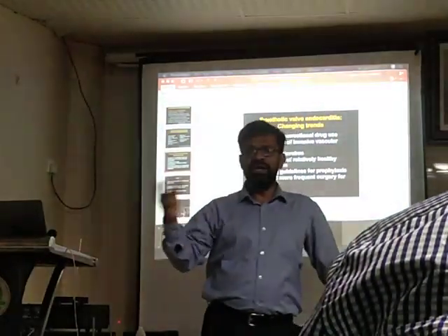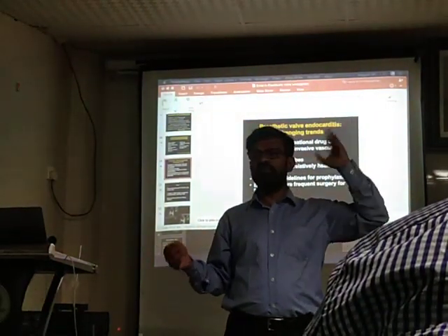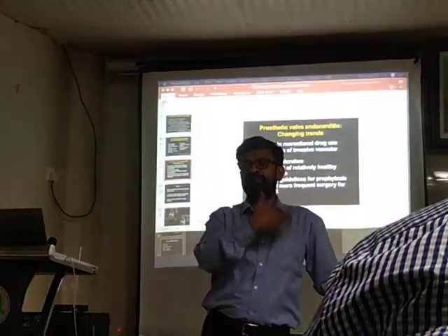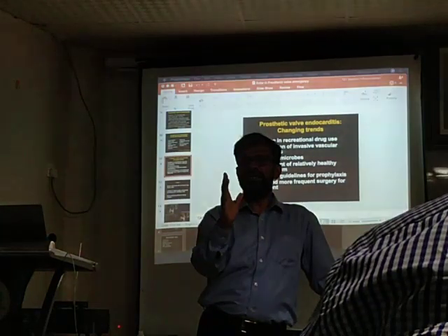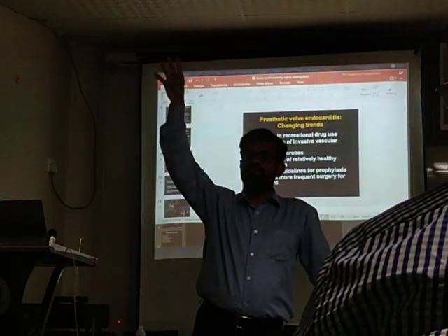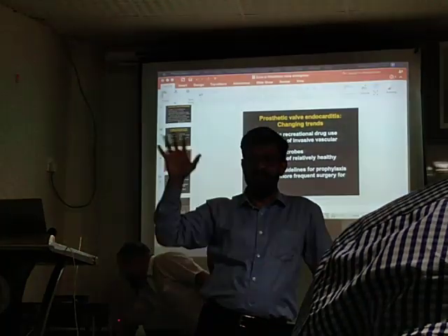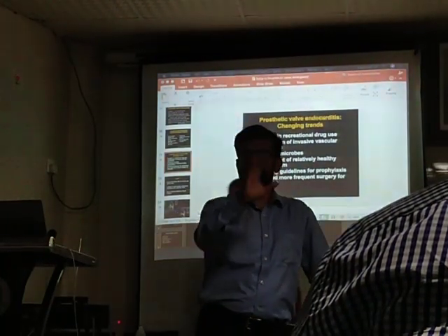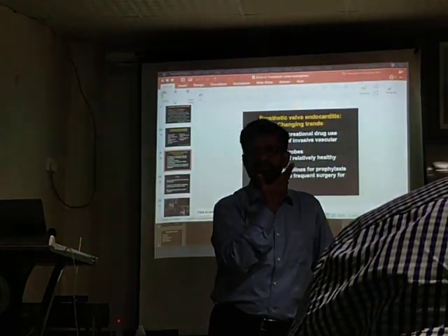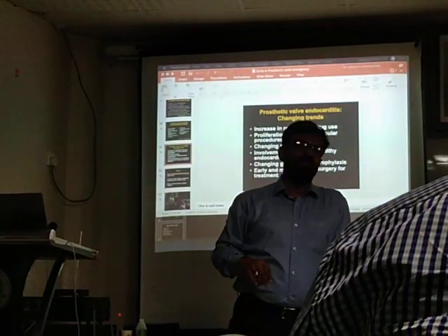At 11 o'clock, you get a patient with acute breathlessness, and you get a prosthetic valve. But you need to say that you need to get a doctor immediately. So, we will have a mitral valve. Just go, align it, put a CW. Let's see the gradient is 24 by 20 or 30 by 20 across the mitral valve. Inform the seniors, admit to ICU, start low dose thrombolysis. If it is a thrombus, it will reduce. Of course, you should have INR, creatinine, all those basic things.